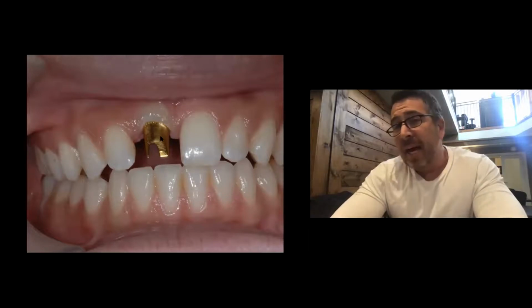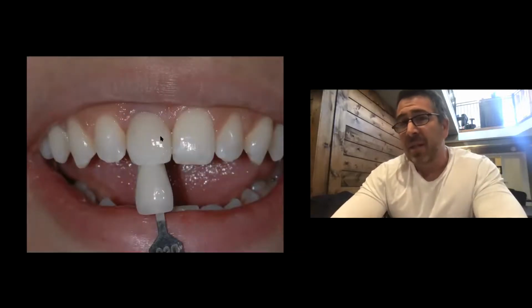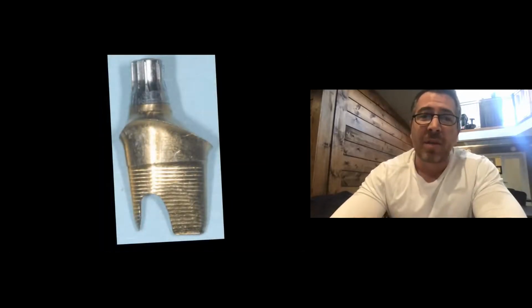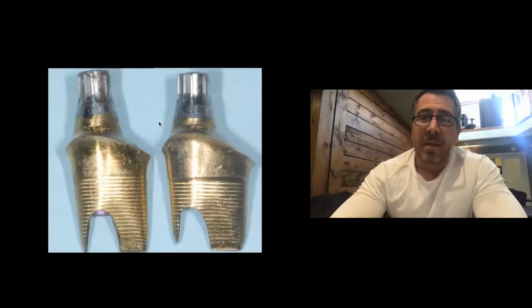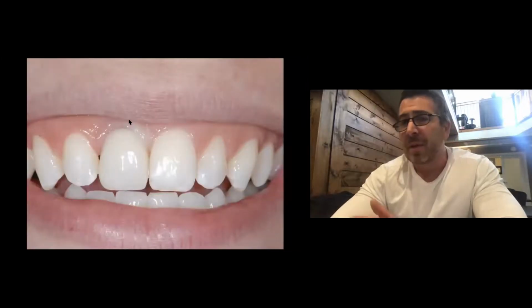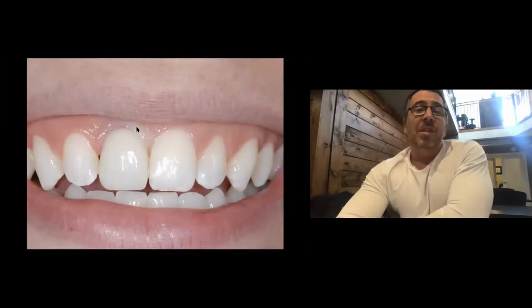Now, I look at that and I say, that's still not enough because look at the crown. The zenith still isn't in the right position. So we say, do it again. So he takes the second abutment and I ask him to make it wider again. And I ask him to develop the emergence on the gingival a little further. That's the difference in the abutments. Look at the gingival contour of the crown. It's over contoured. That's going to put pressure on the tissue on the facial, and that's going to move it apically. So your restoration can change the shape of the tissue.